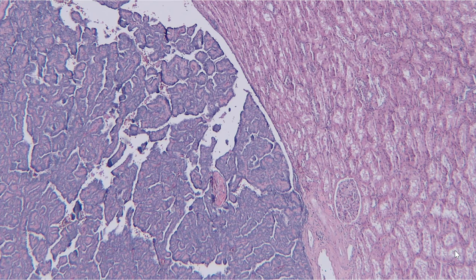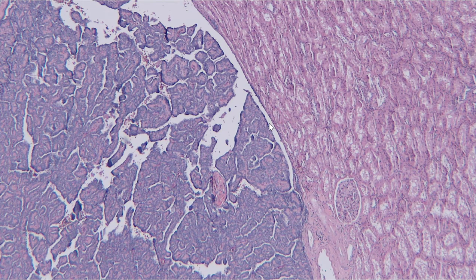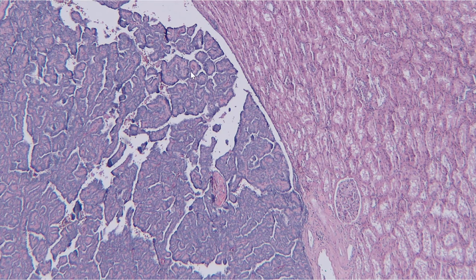From low magnification, what we see here is a very distinct hypercellular blue-appearing tumor with a very sharp border from the surrounding renal parenchyma. And from this magnification, you can make out these papillary-like structures.